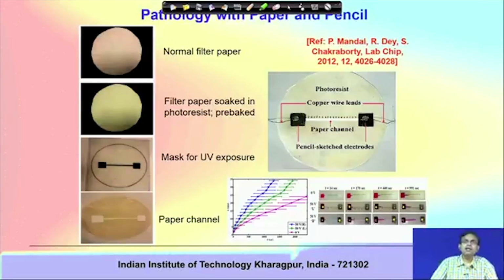One possibility is that instead of using just a simple paper, we use an electric field on the paper to make sure that the blood sample is moved by electrokinetic action. We have already studied electrokinetics in this course, so by this time you already know what electrokinetics is. By electrokinetic action, there is rapid transport of the blood sample from the source to the destination. So, very quick diagnostics can be done.